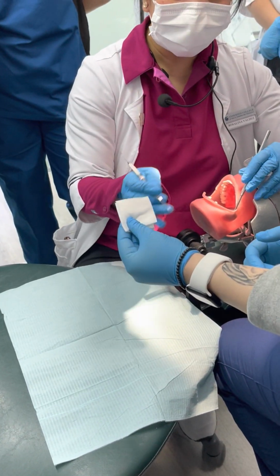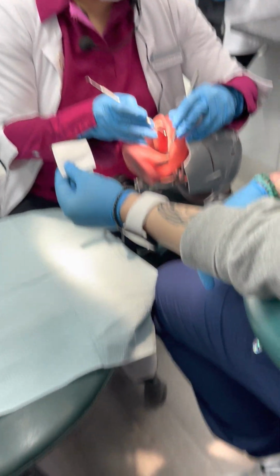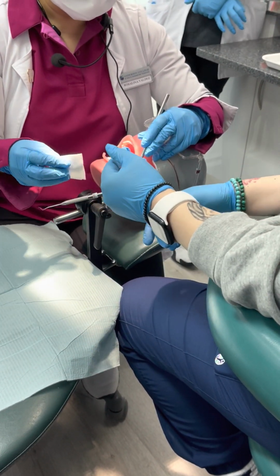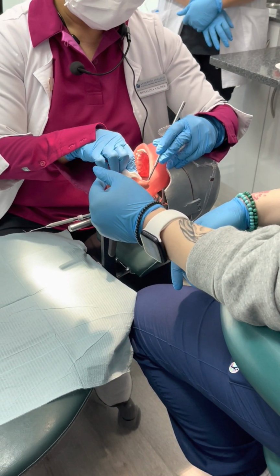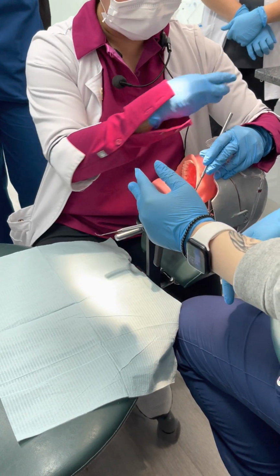Now, I'm not gonna look at your hand. I'm just gonna pass it because I'm more focused on the mouth, or the teeth that I'm working on, right? Do this. Here. Hold that. Do not drop it. Okay. Either your pinky is easier, I guess. What's easier for you? Okay. Now put it back. I don't need that now.